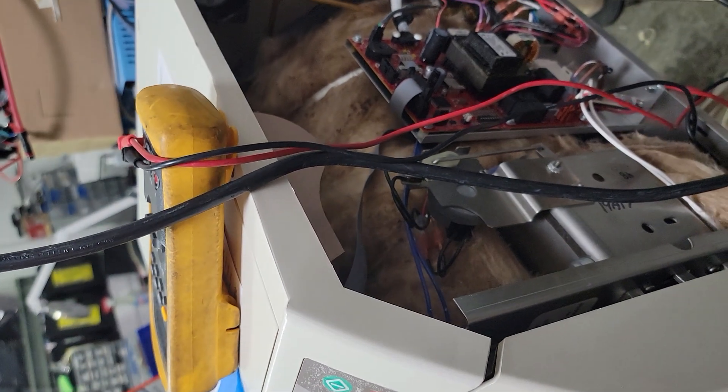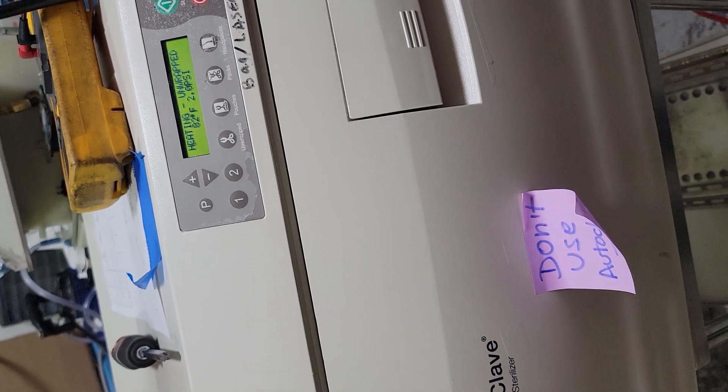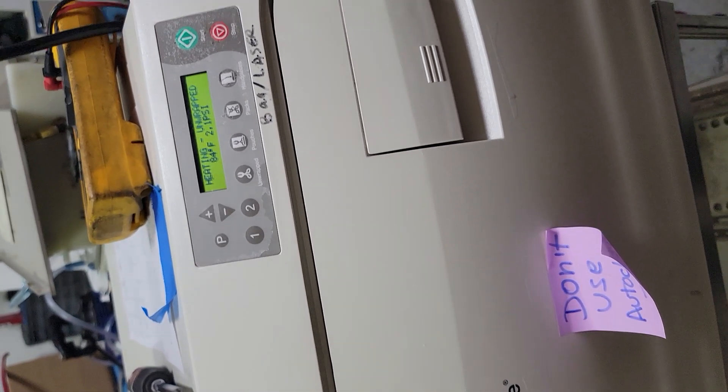Don't mix it up with a Pre-Vac, which actually has pulses — it's actively sucking the air out and having steam come in. Those are very different, on-demand units — I'll do another video on those.